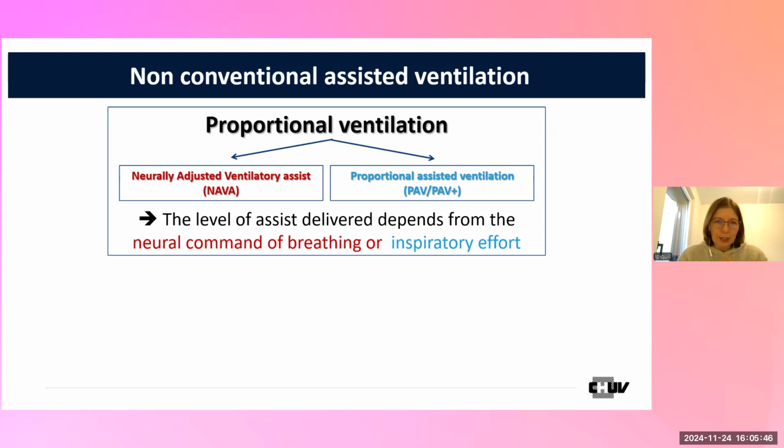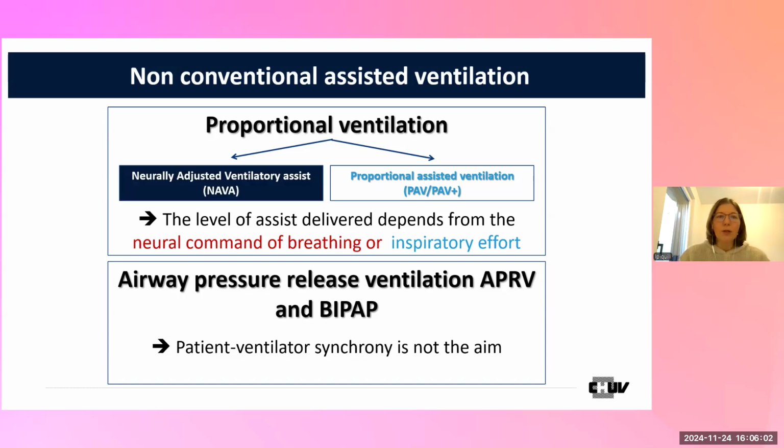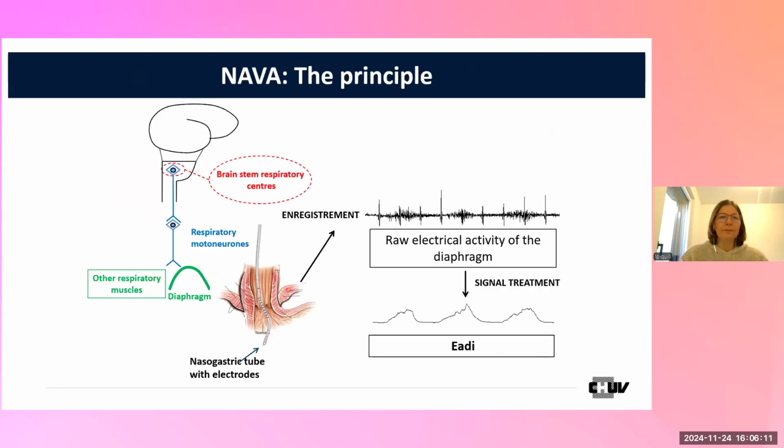Now I'm going to discuss a bit more in detail, first NAVA and then PAV. And finally, we are going to discuss other modes that are totally different. Those are non-synchronous modes. To start with proportional ventilation, let's go to neurally adjusted ventilatory assist.